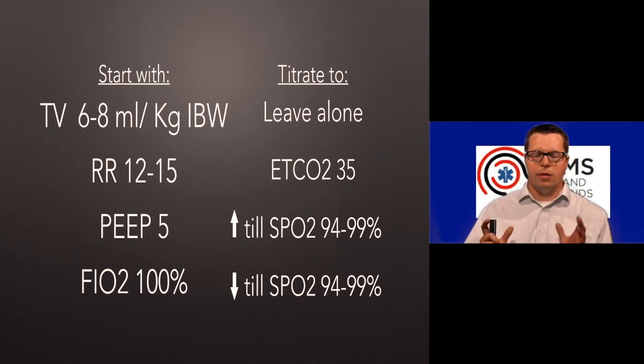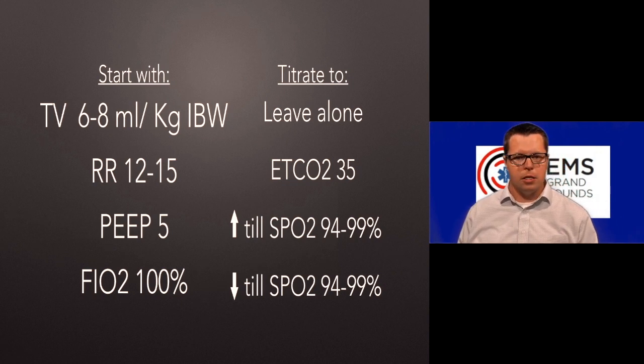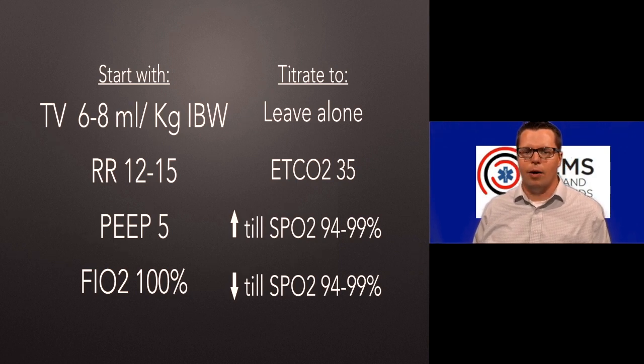I.e. the patient that you are doing positive pressure on, but you don't have a ventilator to use. All this stuff is still important to that person because these are safety parameters, and these are best practice parameters, and these are the things that help the patient get better. So you still got to do all this stuff. Just because you have a bag, that's not actually an excuse to not do the really important critical care stuff, because the patient doesn't care if you have a ventilator or not.